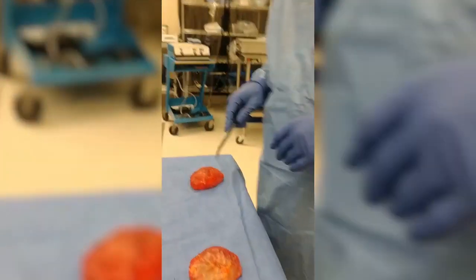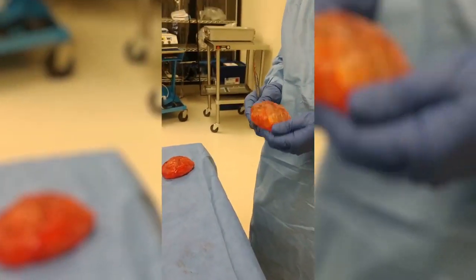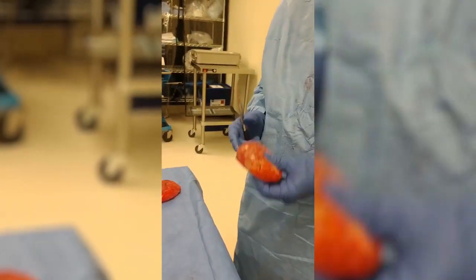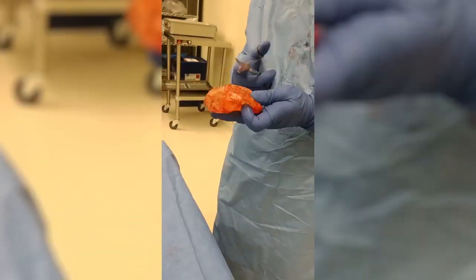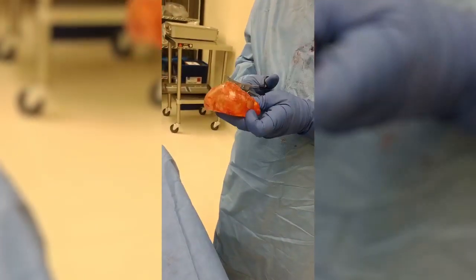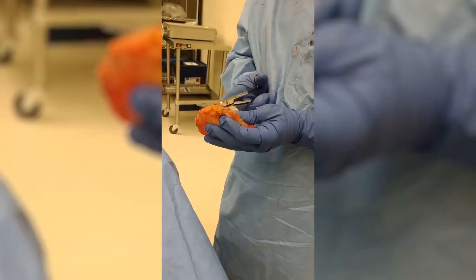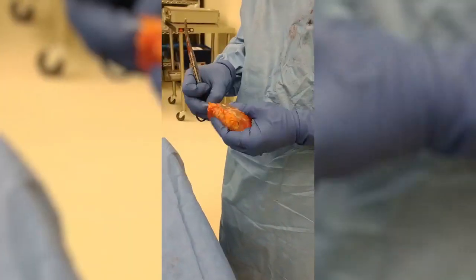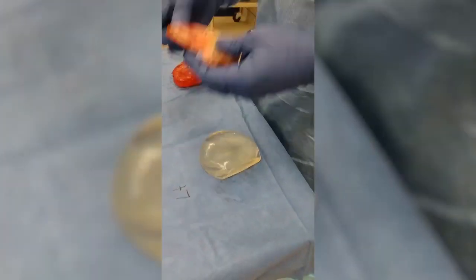We've completed a total bilateral sub-muscular capsulectomy implant removal. This is the patient's left side — that's our implant with the capsule. I'm going to remove it from the capsule now. What we have here is a relatively thin capsule, and the implants are intact. So that's an intact implant with our capsule.